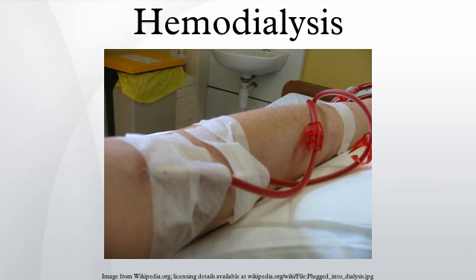In medicine, hemodialysis is a method that is used to achieve the extracorporeal removal of waste products such as creatinine and urea and free water from the blood when the kidneys are in a state of renal failure. Hemodialysis is one of 3 renal replacement therapies. An alternative method for extracorporeal separation of blood components such as plasma or cells is apheresis.